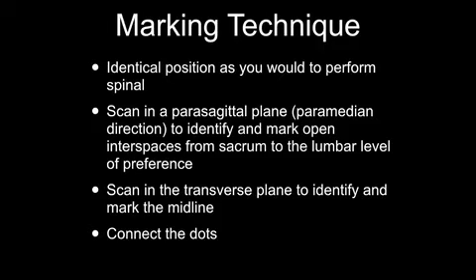Scan in a parasagittal plane, the paramedian direction, to identify and mark open interspaces from the sacrum to the lumbar level of preference. Then scan in the transverse plane to identify and mark the midline. Then simply connect the dots. We will now demonstrate this in images and video.